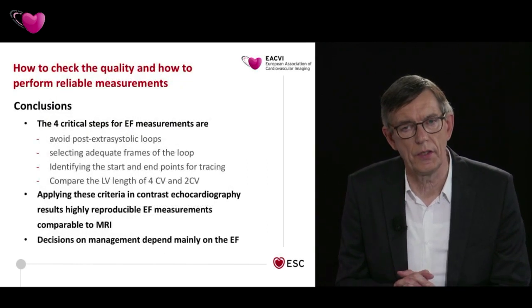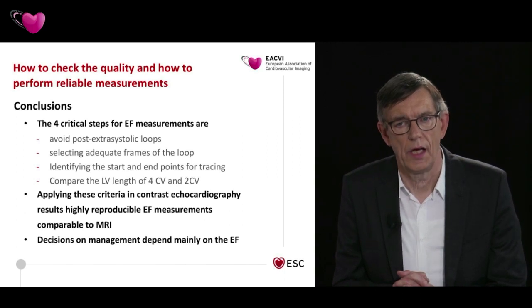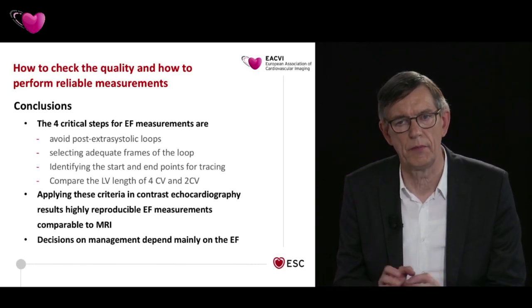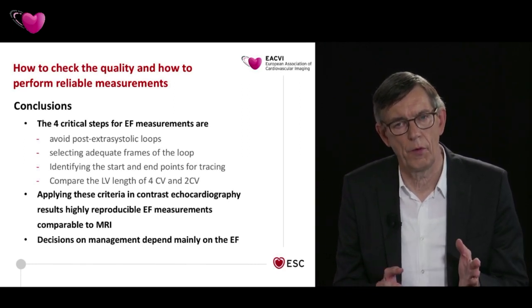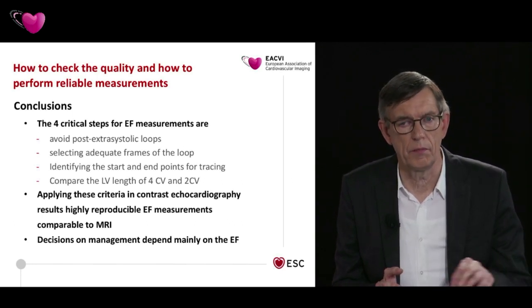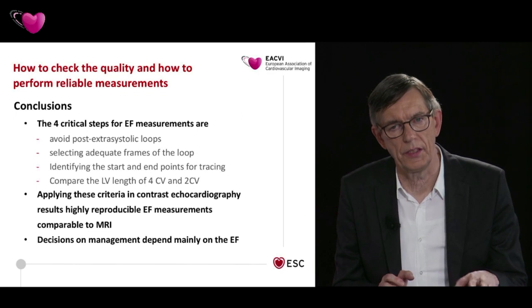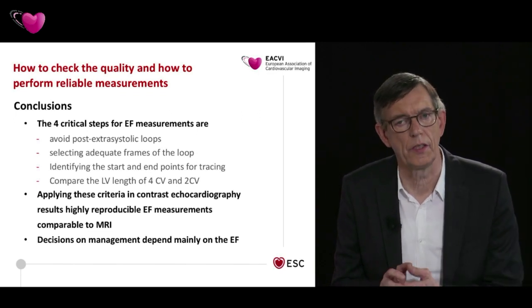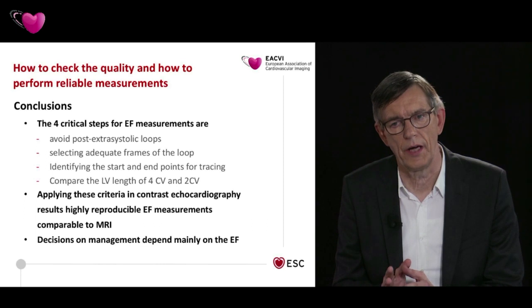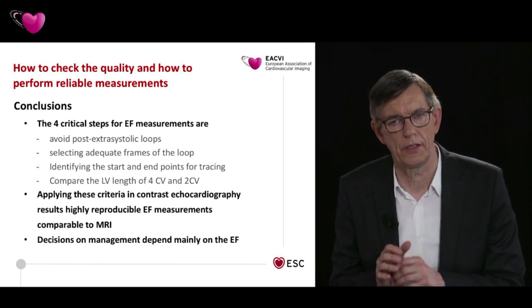So, in summary, I want to conclude. There are critical steps for the EF measurements even after we have acquired optimal images. We have to avoid post-extrasystolic loops. I didn't mention that in my presentation, but that is very obvious, and we also do it when we wouldn't use contrast. We have to select and thoroughly select frames for the end-diastolic and end-systolic frames.